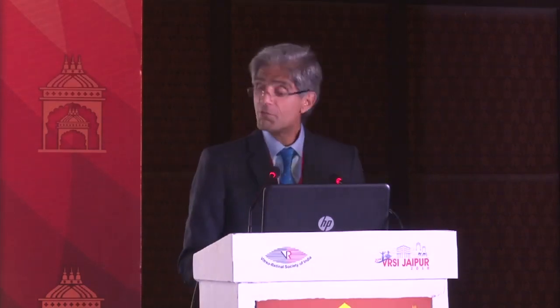I also will use autofluorescence to track the changes that have already developed, and you can see in this time-lapse video there's very obvious progression of disease despite discontinuation of therapy. And again, on this montage as well, you can see progression over the years in this patient who stopped therapy. Other entities that perhaps in the future may be important include quantitative autofluorescence, as you can see in this slide. Tools that we've used in the past, such as fluorescein angiography and full field ERG, are really not useful in detecting early disease. Here you can see a bullseye maculopathy with fluorescein angiography, but this is already a very advanced change, as you can see on the visual field.